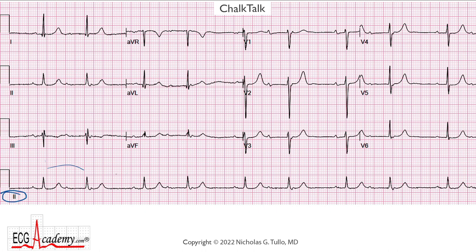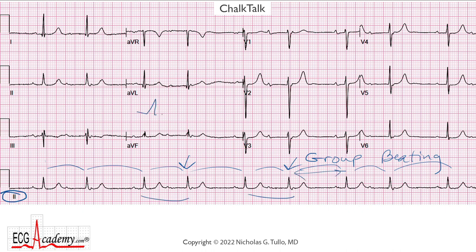The R-to-R intervals are shorter, and then longer, and then shorter, and then longer — so it's regularly irregular. I like to refer to this as a bigeminal rhythm because every other QRS complex is earlier. Some people will also refer to this as group beating because you have groups of two. Normally group beating is pretty obvious with long pauses between groups, but here the pauses are very subtle.